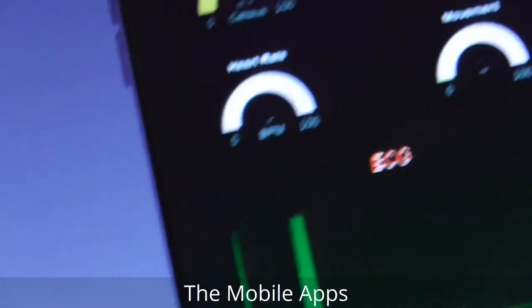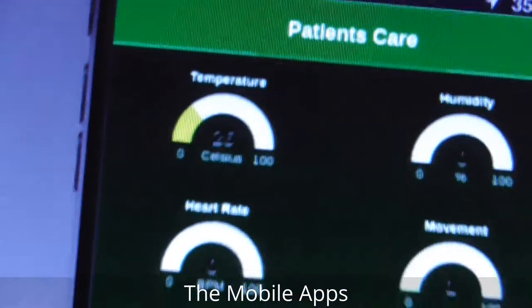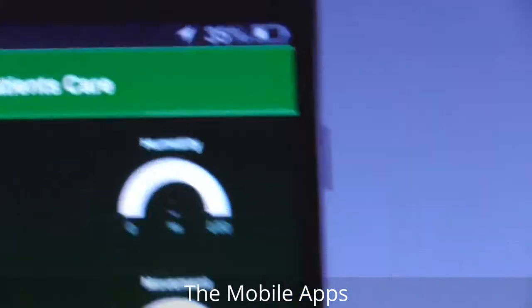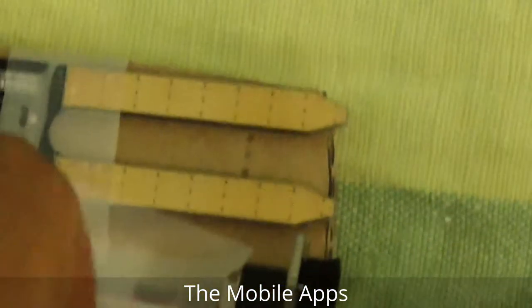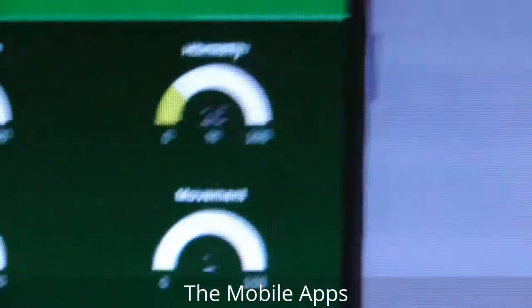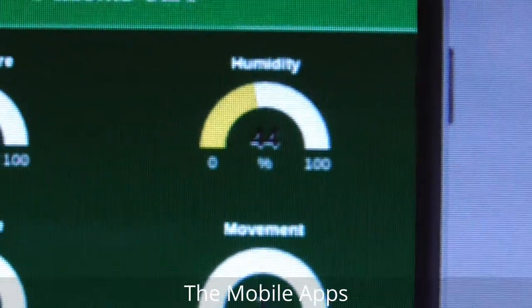Let's check the humidity. This is the humidity sensor I used. I'm not sure exactly, but now you can see a change — it's now at 44.